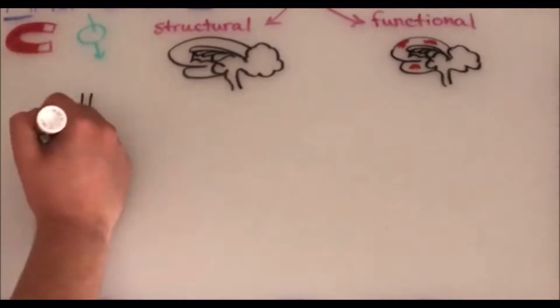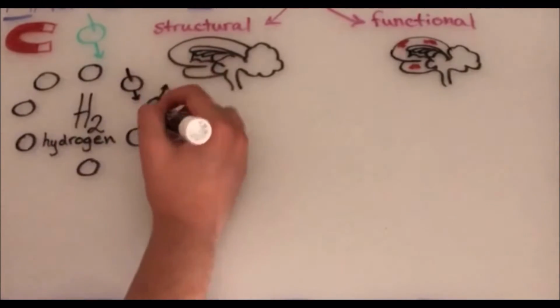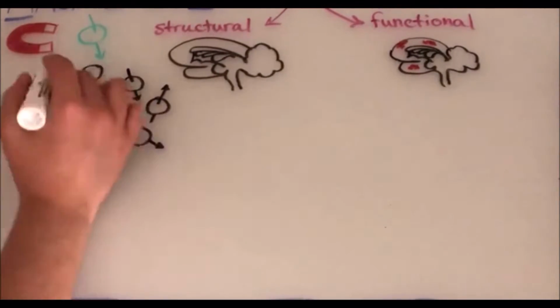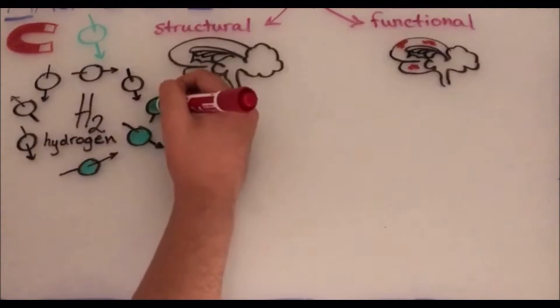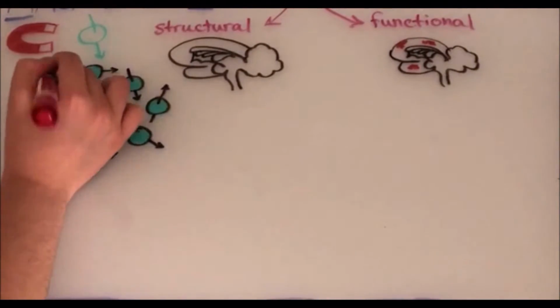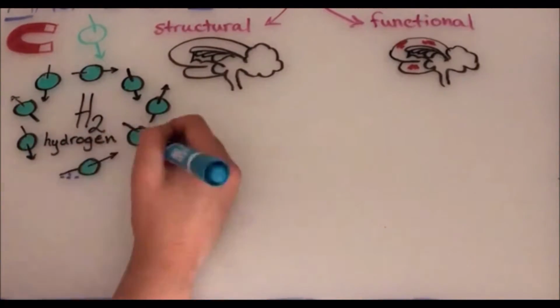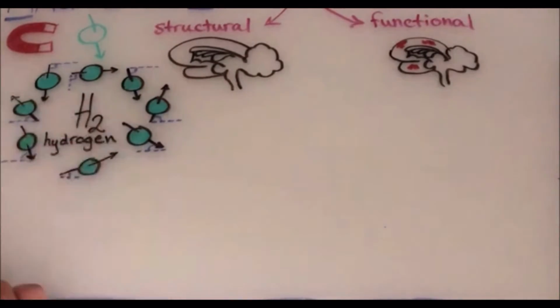So, hydrogen, like any other element, exists as atoms, and each one has this thing called spin. It's like an axis that humans draw on it as a reference point indicating a magnetic property. And in an environment where these atoms are left alone, the angle of their spins will all be different, random, and will change according to their very own surroundings.